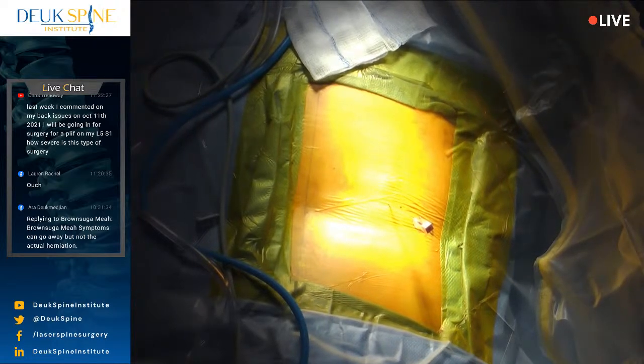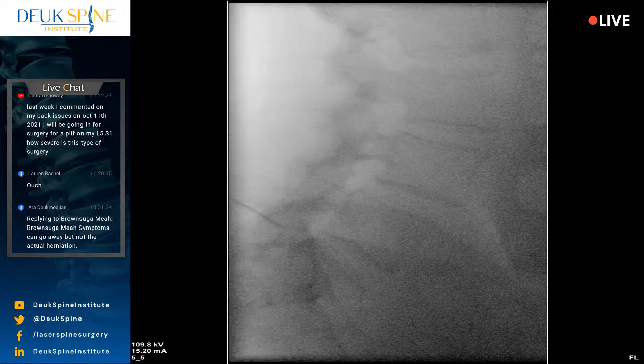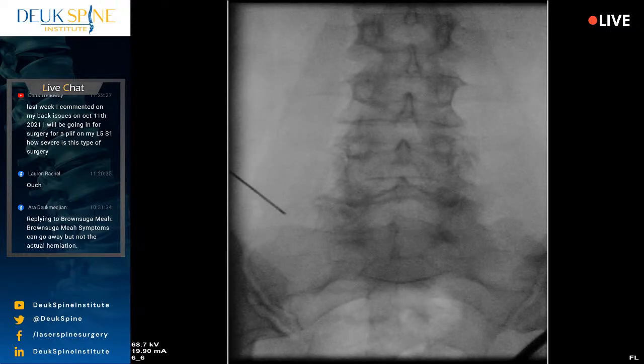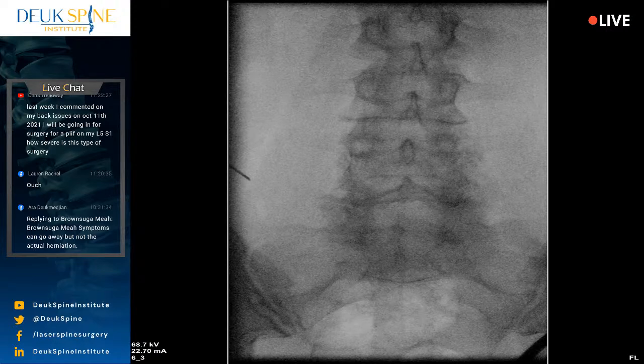Shot. All right. I need your help, doctor. AP. All right. We're probably going to have to reposition the fluoro because she's moved. Yeah, you're doing great. Just relax. Everything's okay. Go back to a lateral, please. You're going to have to reposition the lateral. Yeah, let's get that blood pressure down.